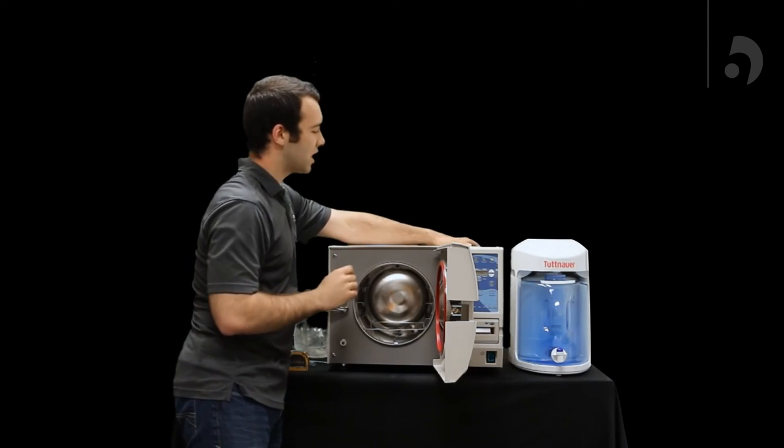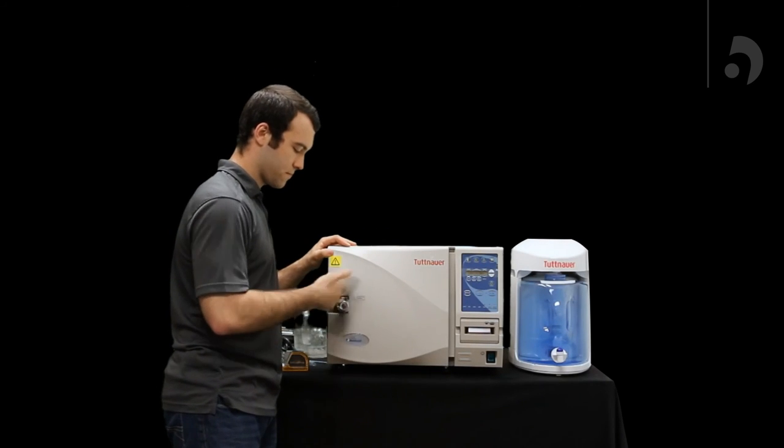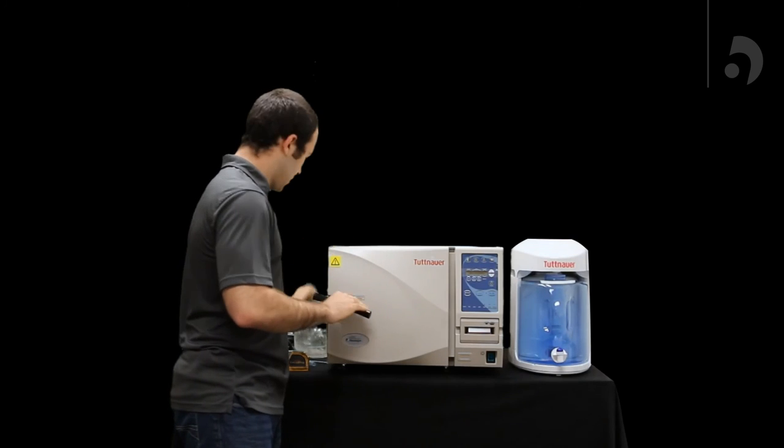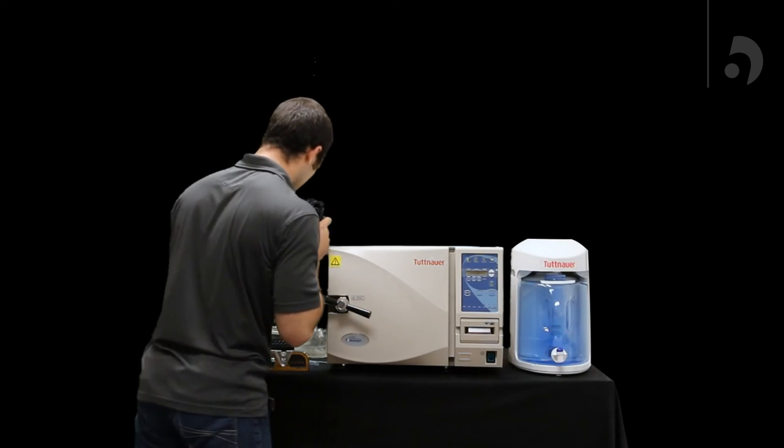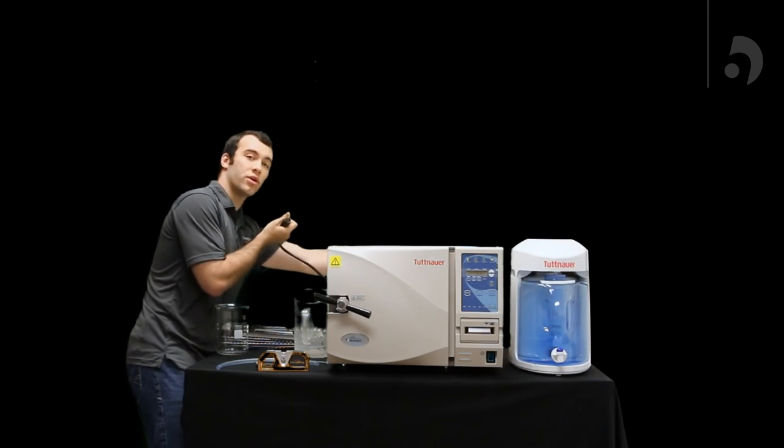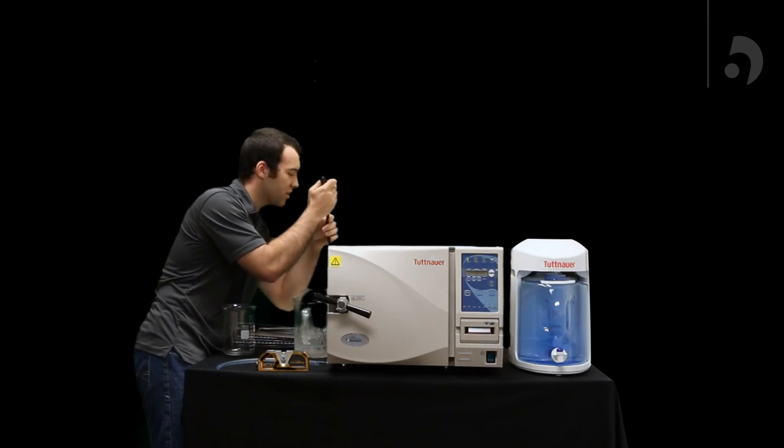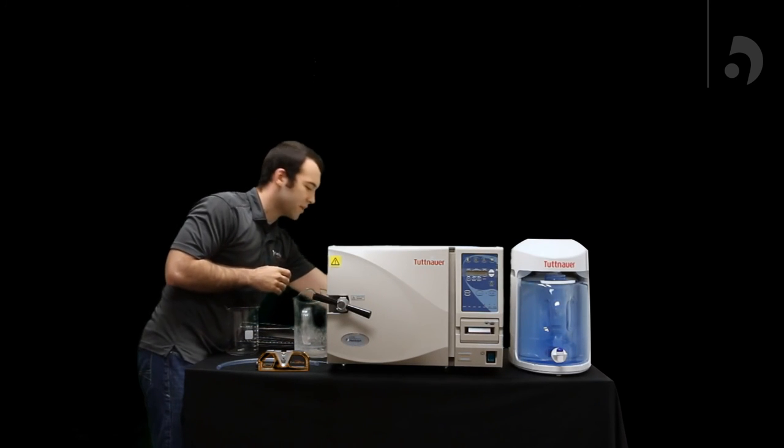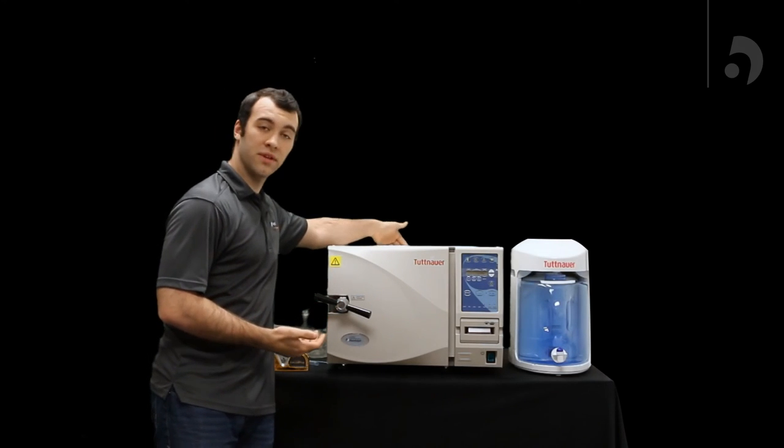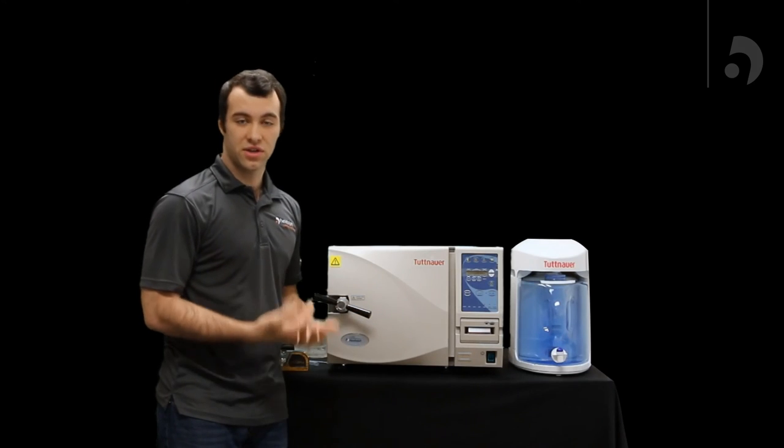Now, you're going to toss your reservoir cap back on and close your chamber. And we can go right into plugging in your power cord. You'll find that's in the bottom corner of the unit. And then just plug the other side into an outlet. Now, once that's all good to go, you can flip the switch in the back, flip the switch in the front, and you're ready to start sterilizing.